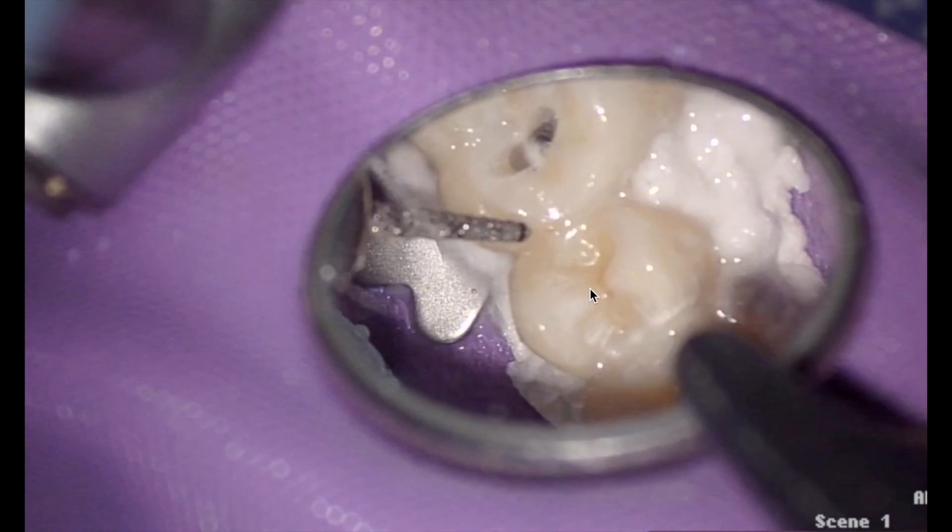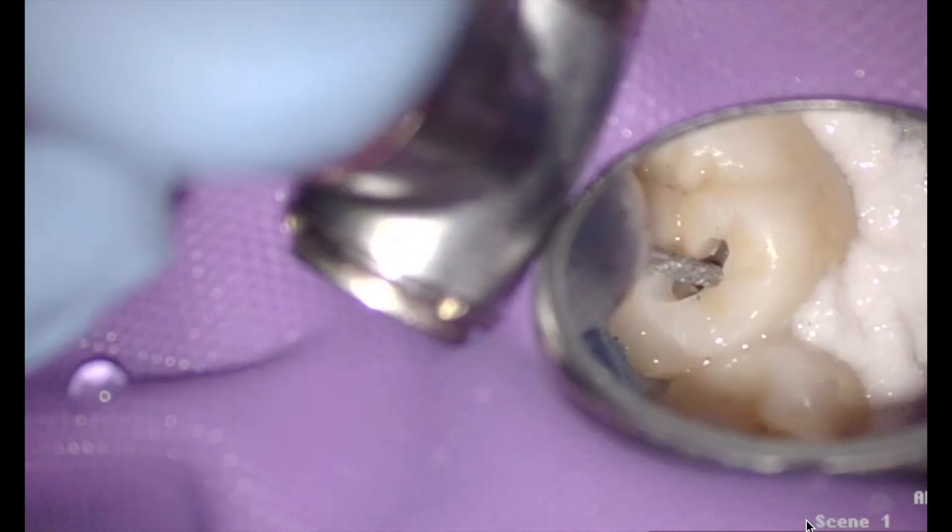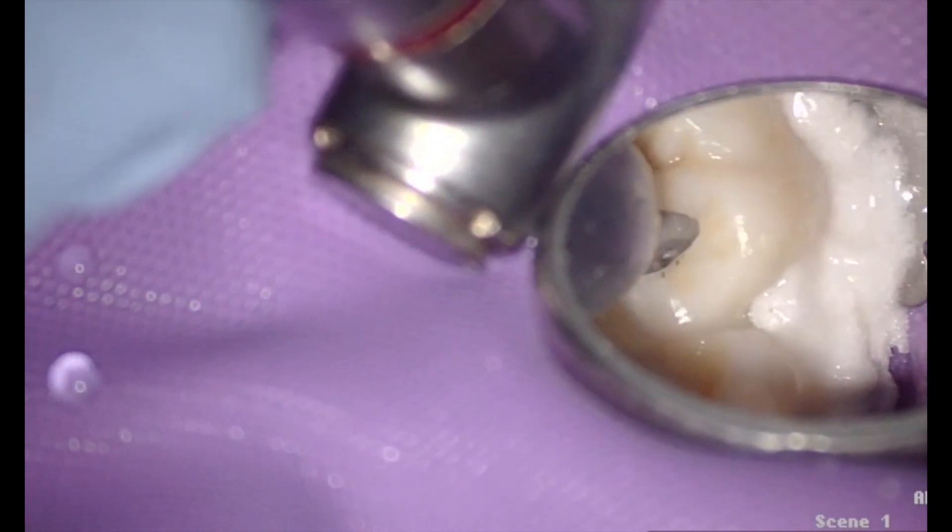So let's just keep rolling. The best advice is grab a super coarse zirconia burr — and it just cuts like butter.